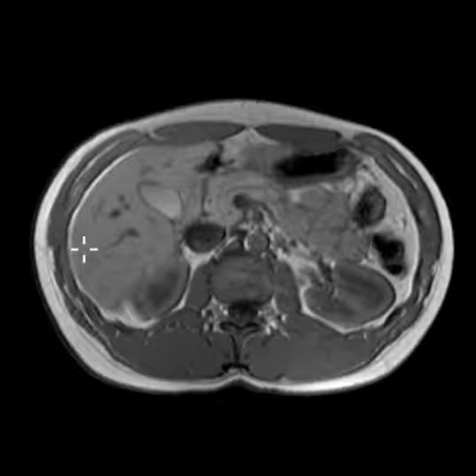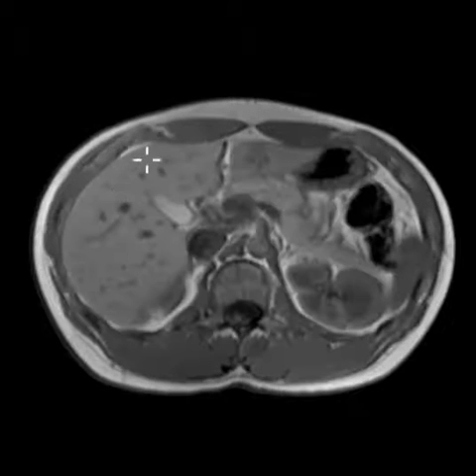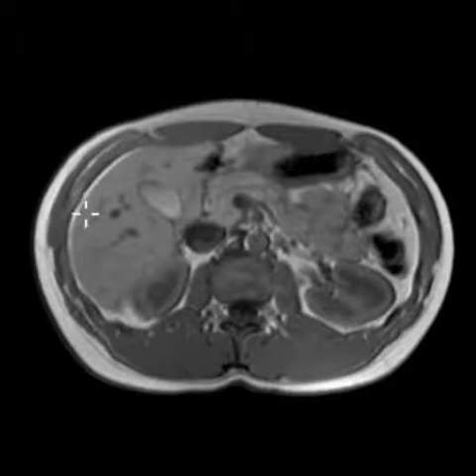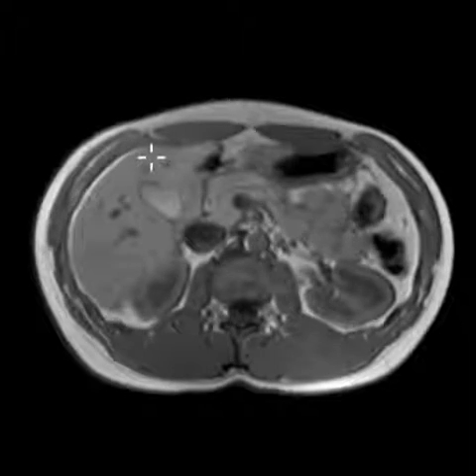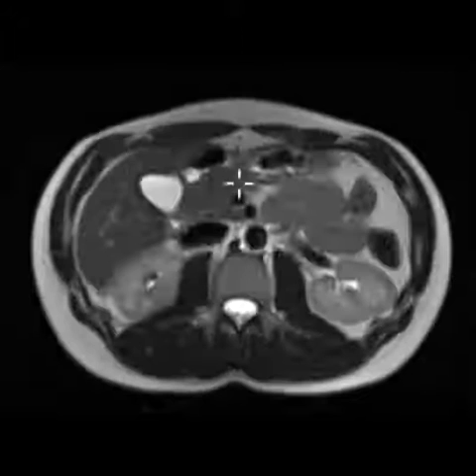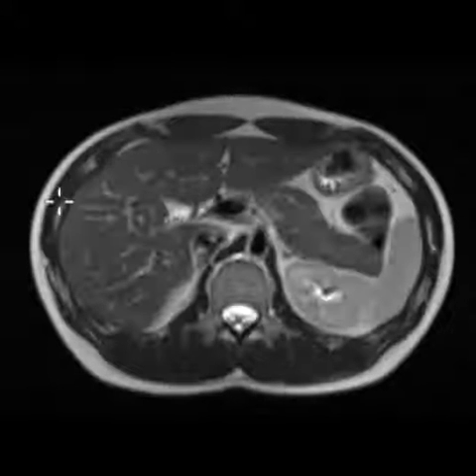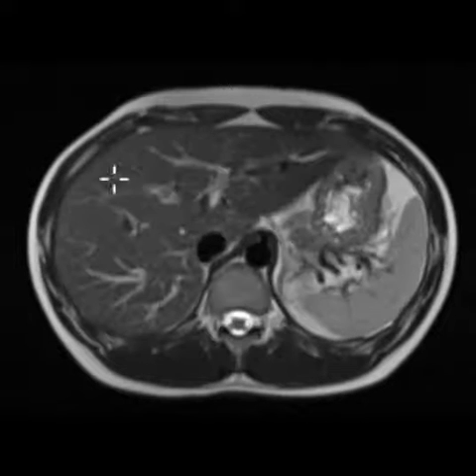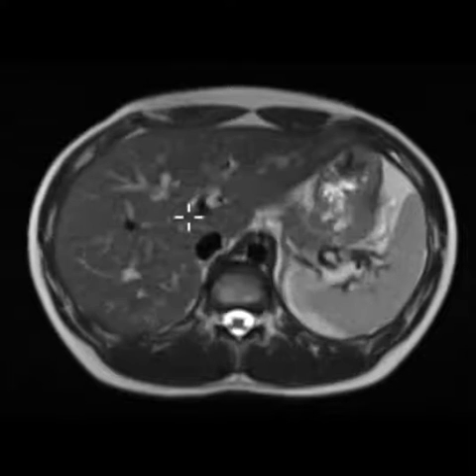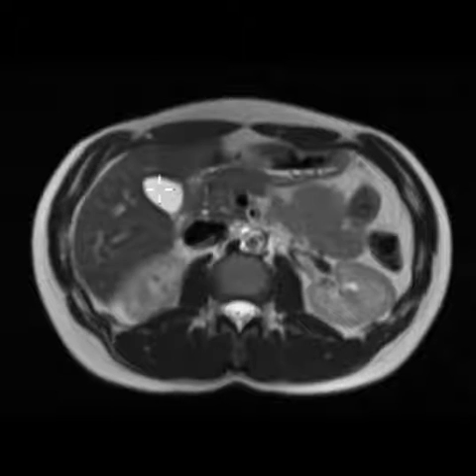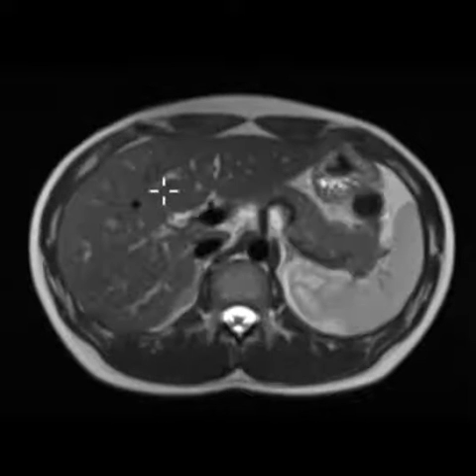We also look at the contour of the liver to see if it's smooth. When people have cirrhosis or liver disease, the contour will become more lobulated rather than nice and smooth. They can also get shrinking of the liver — contracting down and losing volume — and they may get fluid surrounding it called ascites. They can also have solid masses; some are benign, some are malignant. Cysts in the liver look much like the gallbladder — you can see little areas of brightness — and those are very common and usually benign.